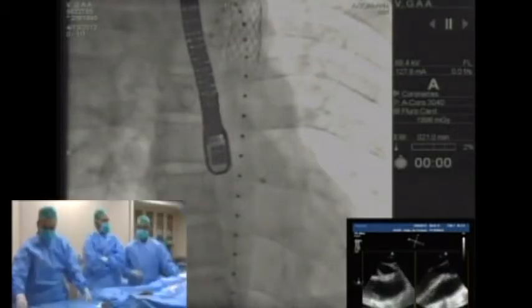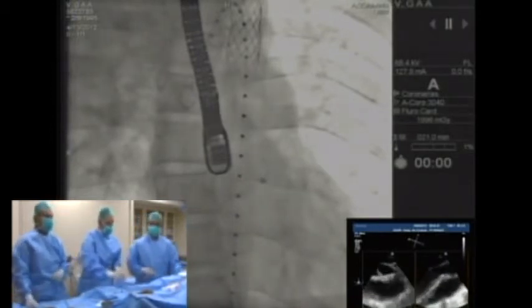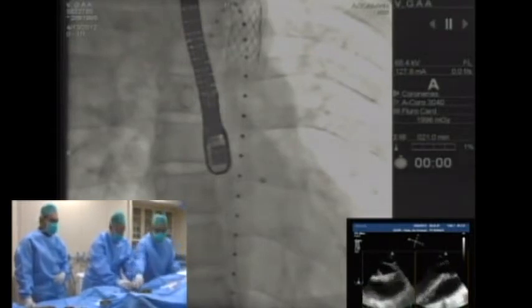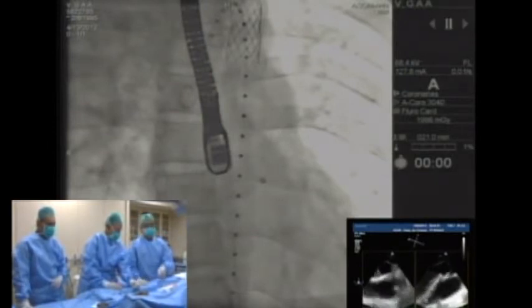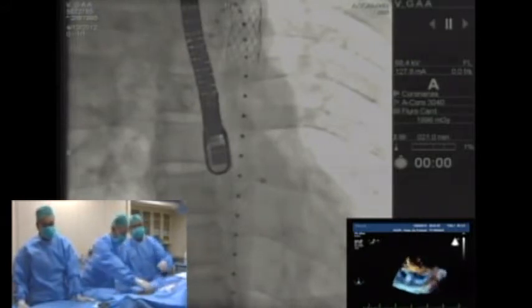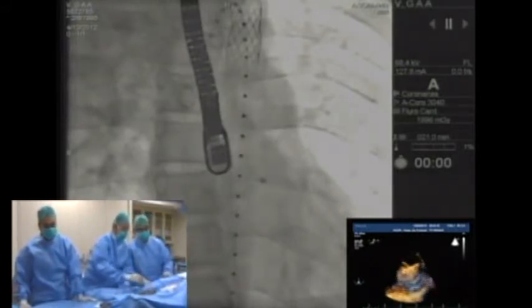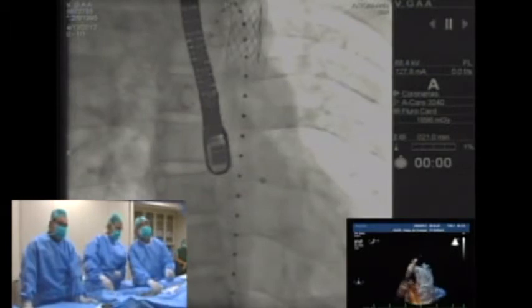Cesar, everybody knows that you have lots of experience with this procedure. We're planning to use a LifeTech device. You just published a very nice paper in CCI. Would you like to make some comments on how we select the device vis-a-vis the size of defect, please? I think in this VSD we can choose the type 2, and if it's 4.8 and 5 millimeter, I go ahead with the symmetric device. That is, both discs are the same, and I choose the number 7.